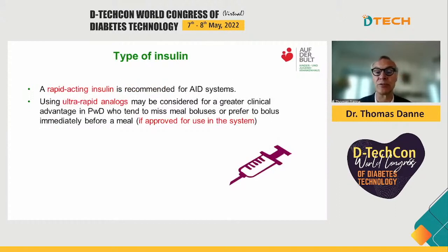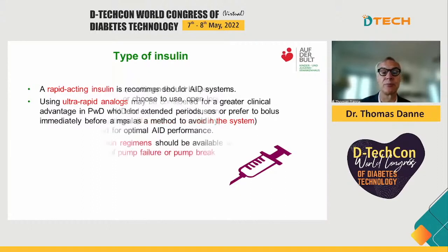The recommendation regarding insulin is to use rapid-acting insulins. I think we're still looking for the ideal pump insulin. You can, of course, also use ultra-rapid analogs when approved for the system. And as of now, there's limited approval.